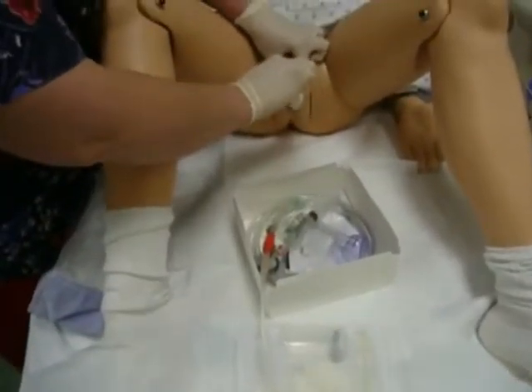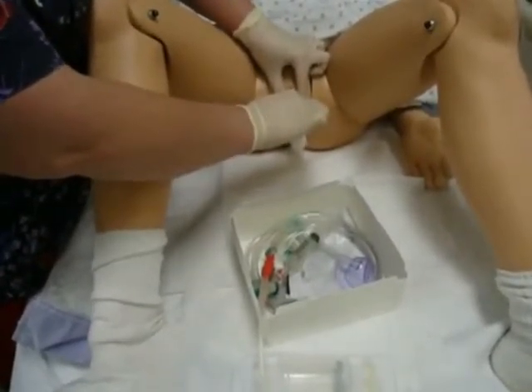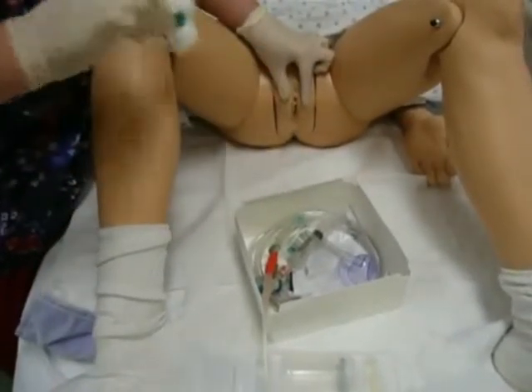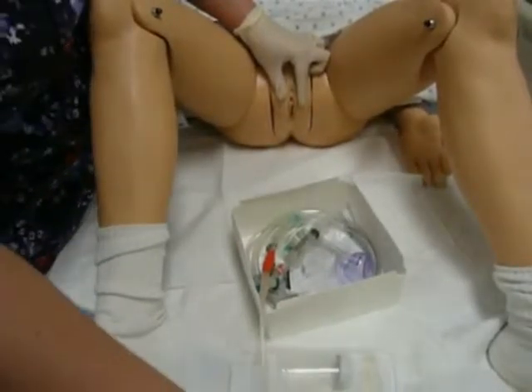And I'm going to come in and cleanse her off. Now you can go side, middle, side, middle, side — it doesn't matter as long as you're cleansing the whole area. You do one swipe down. I need to move my cotton ball around my sterile field to make sure that I do not cross over.